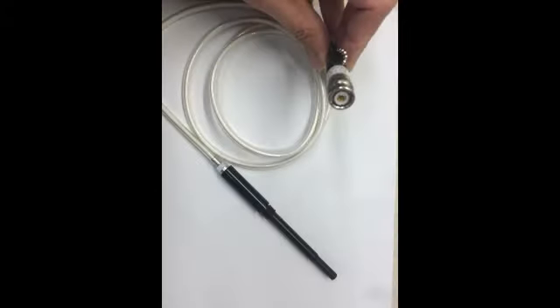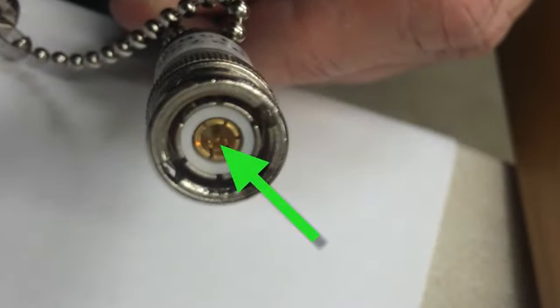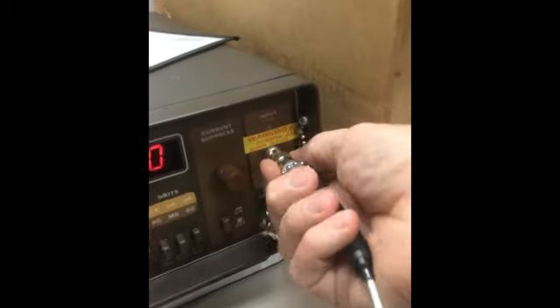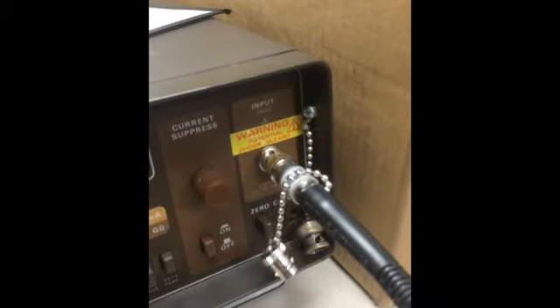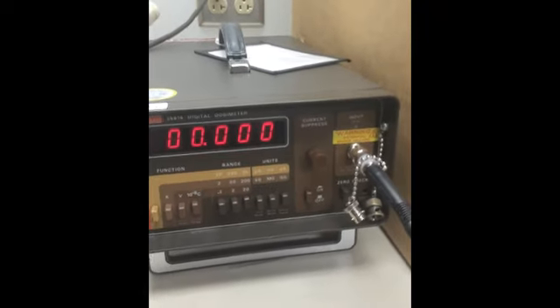So here I'm showing the electronics for the chamber, the wires that are connected, and I can zoom in here. What you'll see, if you look closely, is 3 electrodes: the inner pin, and then 2 outer electrodes that are at ground. This is where you collect the charge from the pin in the middle. This chamber plugs into an electrometer I'm showing here. That's the device that allows you to apply voltage and also to read out charge.